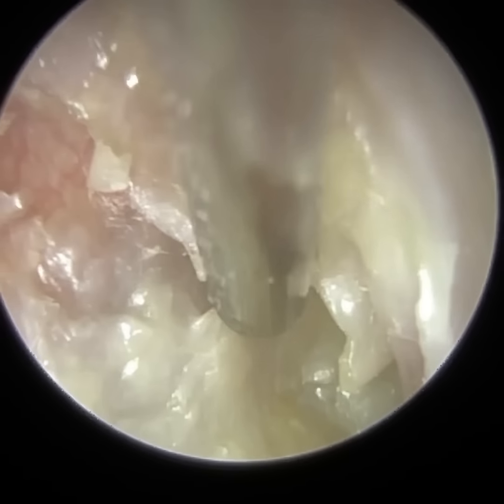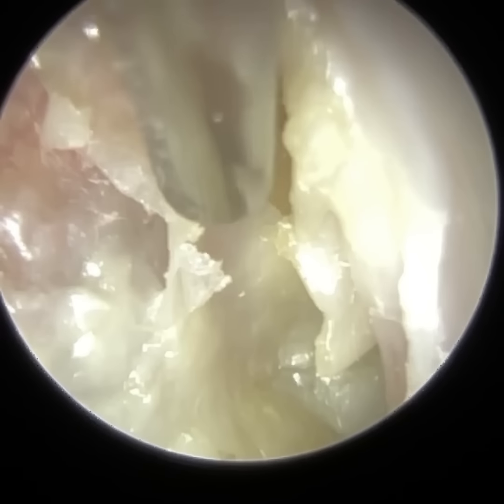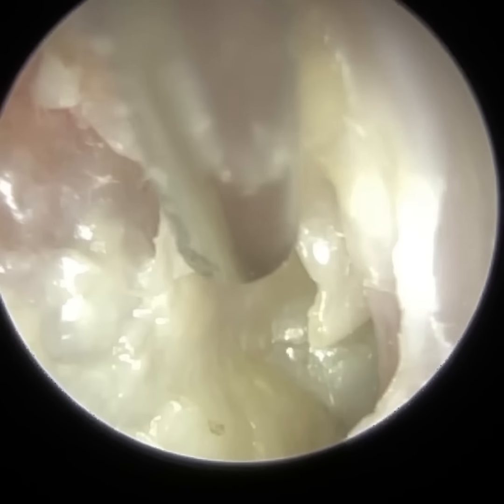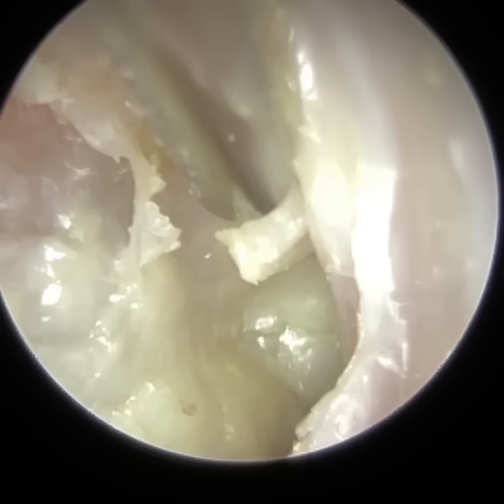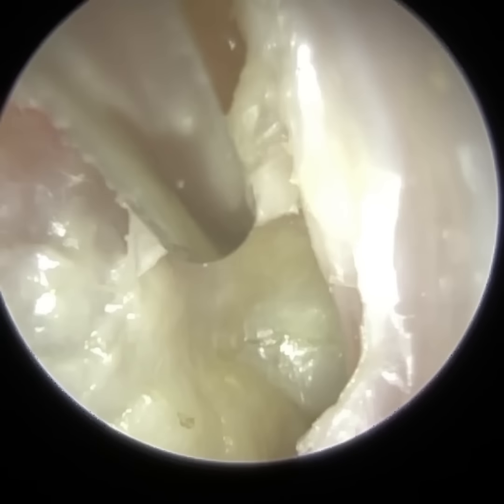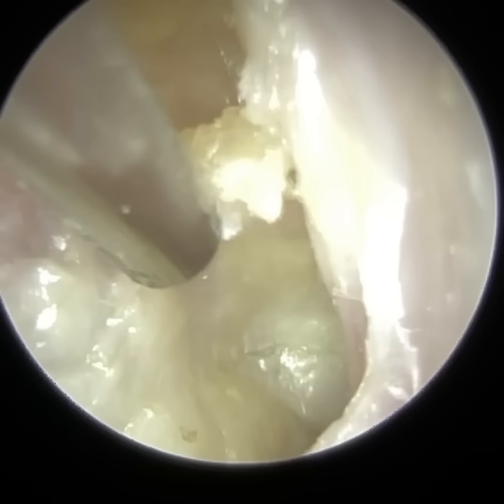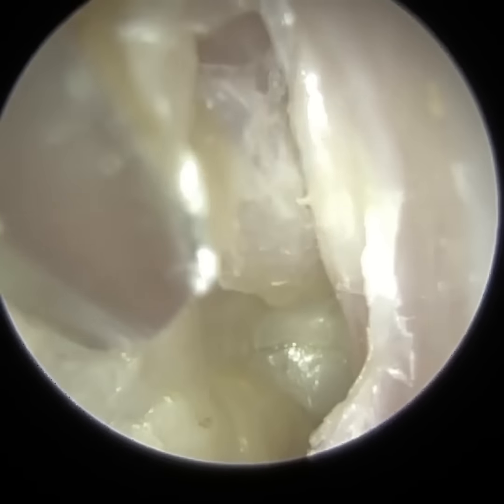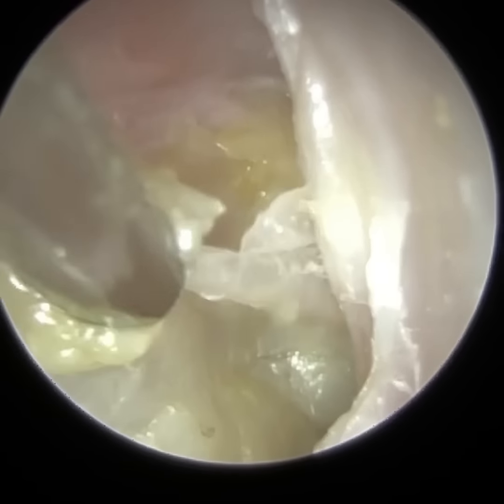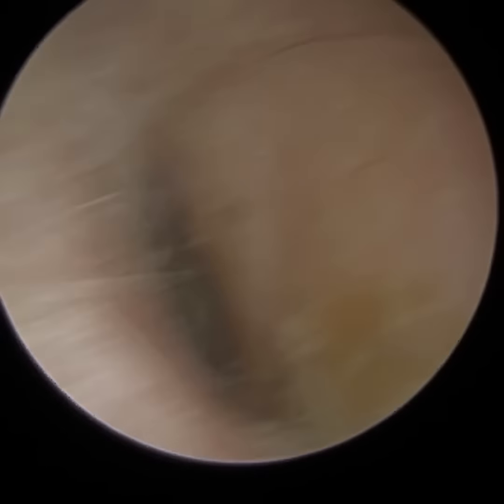Now, with the French gauge system, they don't always provide you with the internal diameter, which is probably for me just as important as the outer diameter. With the Birmingham gauge system, you do typically have the outer and inner diameter of the suction tube. So normally it's about 2.1 millimeter outer diameter, and internal diameter it's 1.6 or 1.7. So the wall thickness of the suction tip is very, very thin.